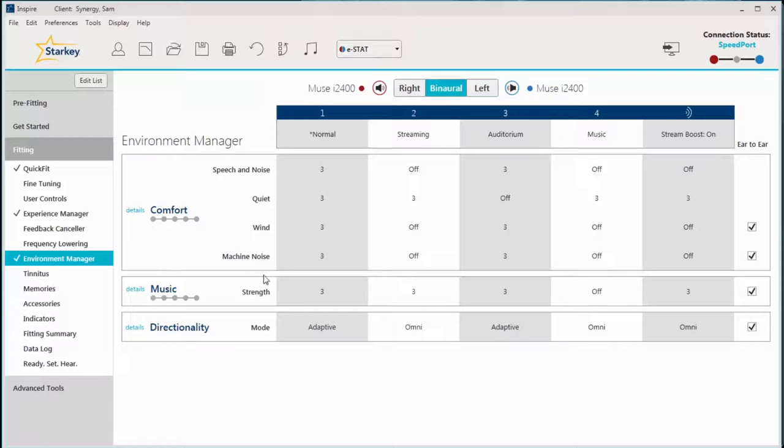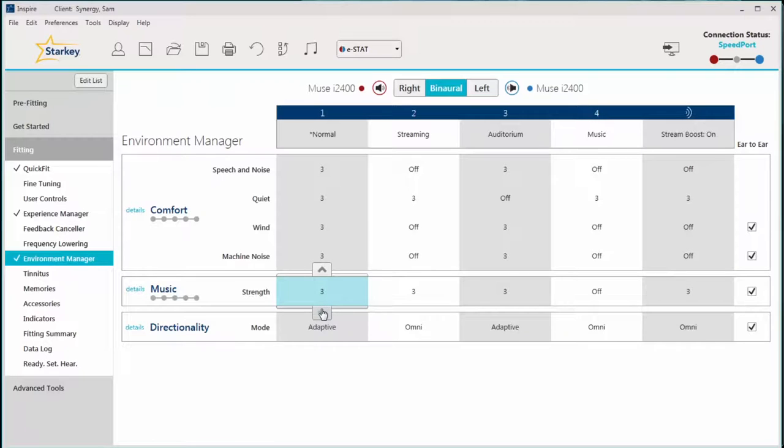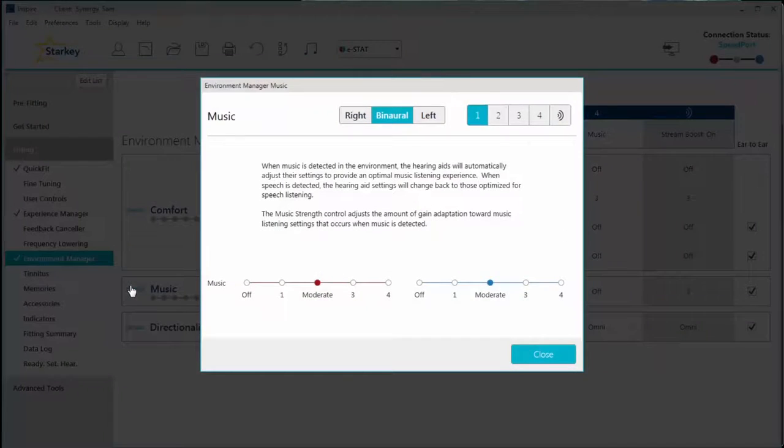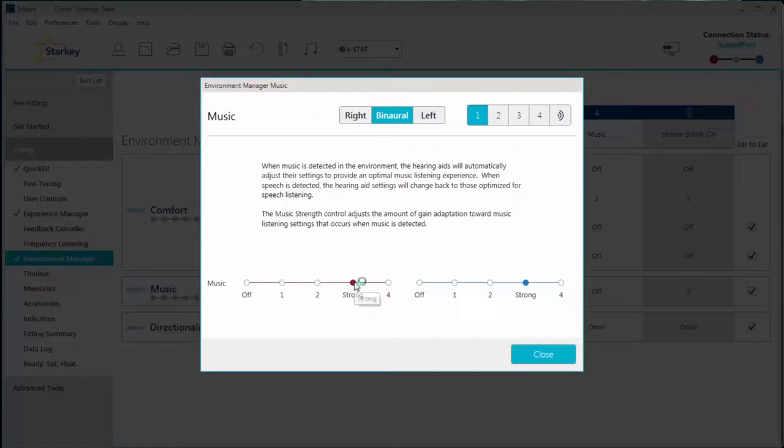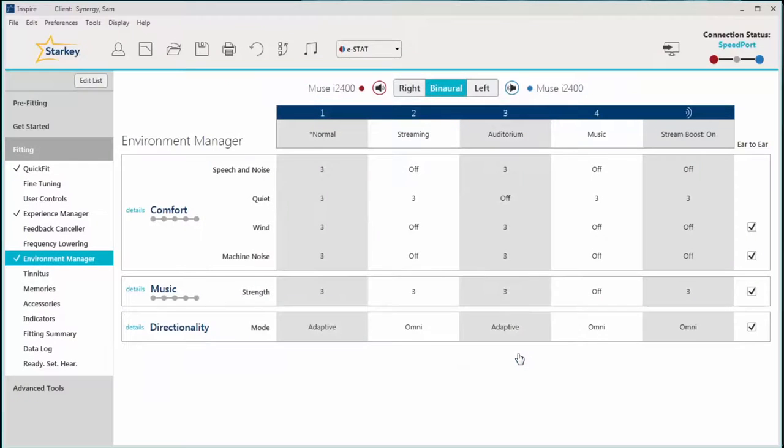There are two ways to adjust the feature if necessary. Select the setting value on the Adjustment Table found on the Primary Environment Manager screen, and use the up or down arrows to make background music more or less robust respectively. Another way to make changes is to select details adjacent to music and select a higher or lower radio button to make music more or less robust as needed. Adjustments should be made based on subjective feedback provided by the patient.